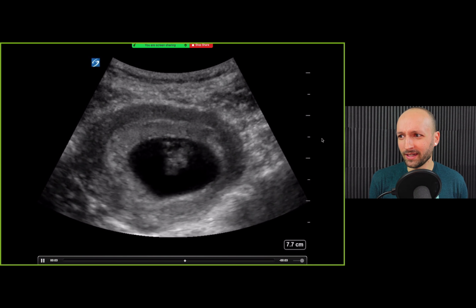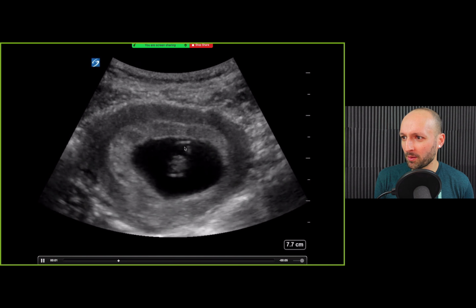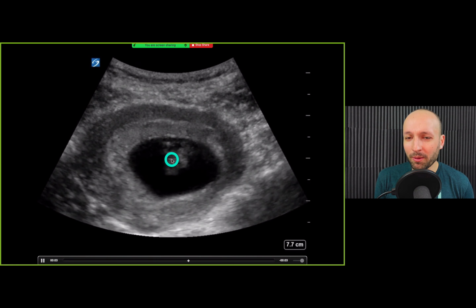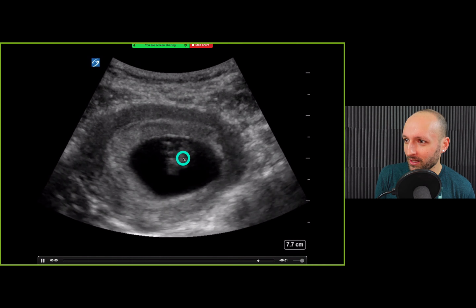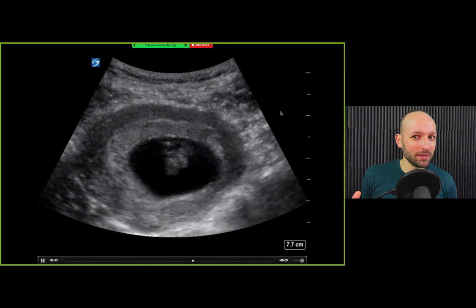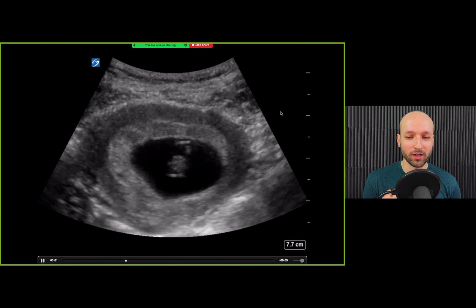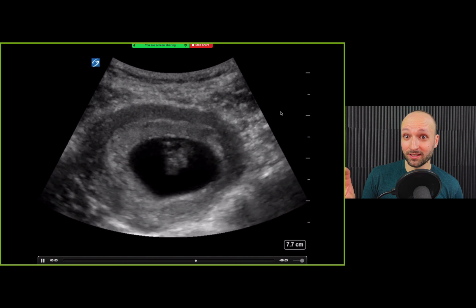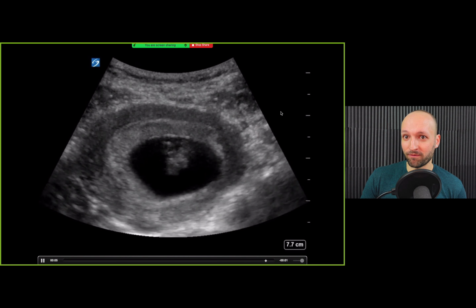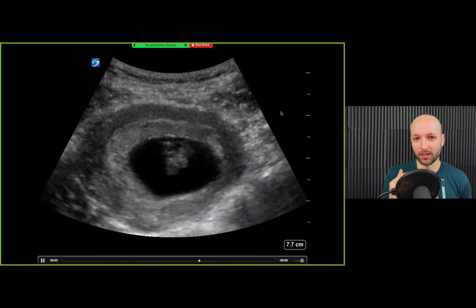Is that a baby? It is a baby for sure. We have an endometrium up here. We have a gestational sac, and we got a little itty bitty baby right here. And I even see a little beady boy right there, right? Now, can somebody read my mind? I would like somebody to read my mind, please, and tell me why I have a hard time with this image itself. Why this is inadequate from my point of view. Read my mind. Anybody have any questions? Or thoughts on that, I guess.